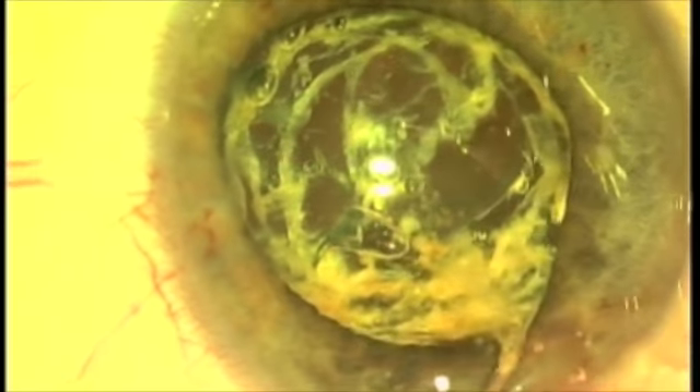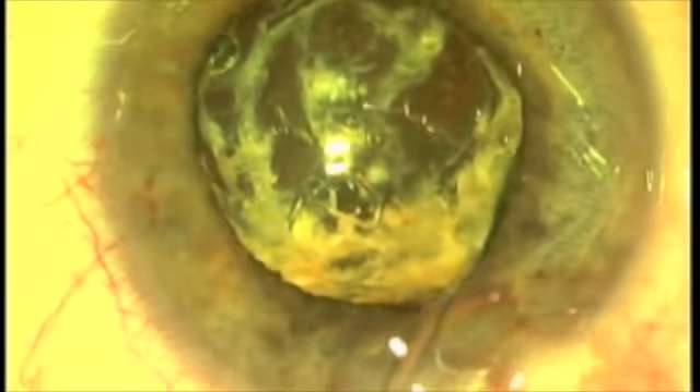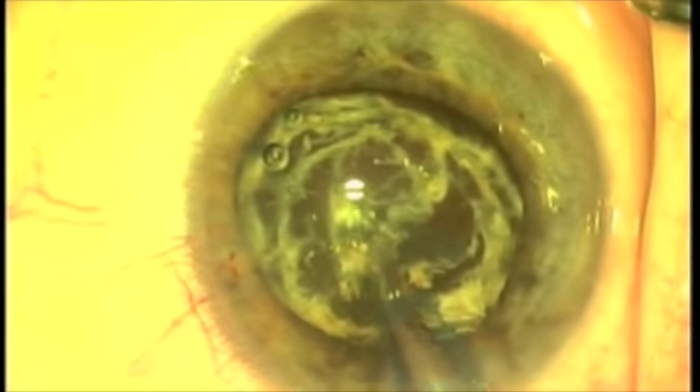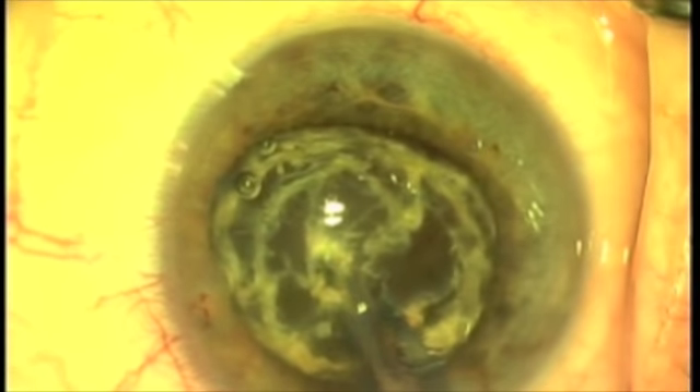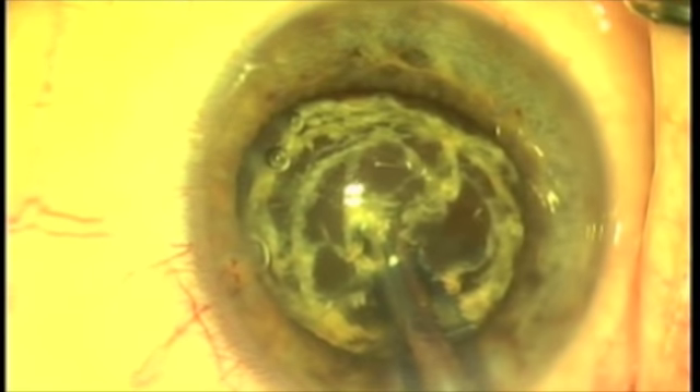We've made this capsulotomy. Now we're hydro-dissecting. You can see those little ablation path sections that are opaque — that's fragmented or broken pieces of the molecular lattice.